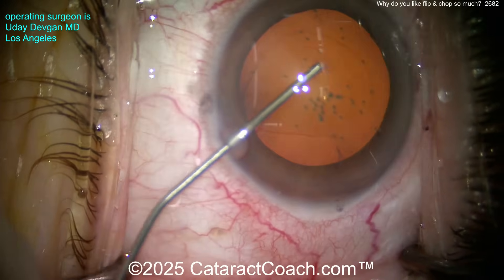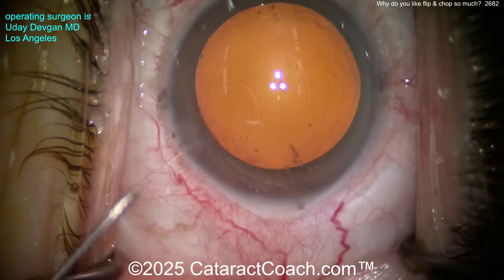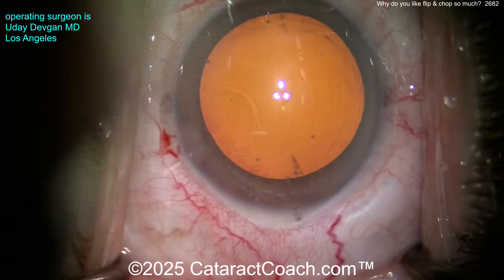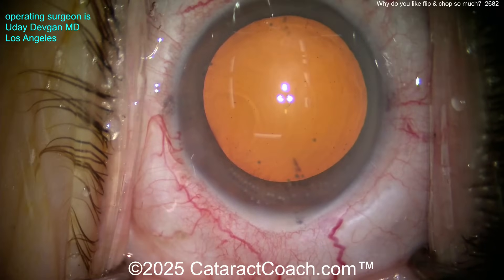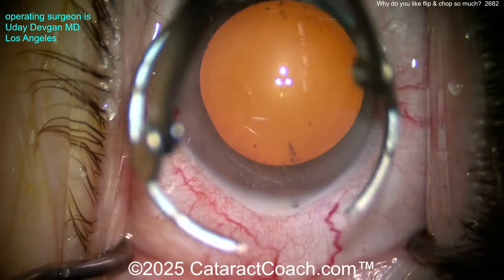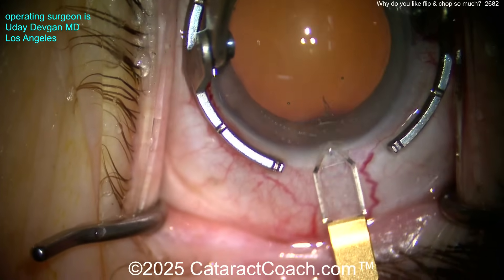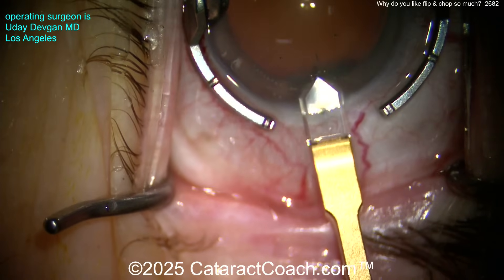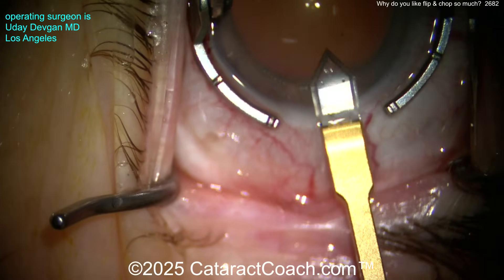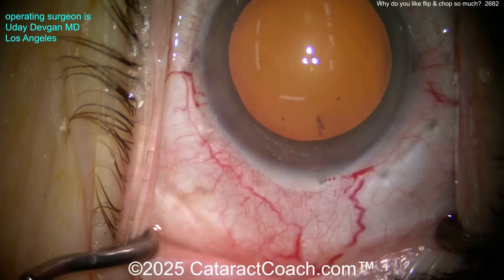Here comes our dispersive viscoelastic. Get a good fill here across the eye. Now we're going to make our main incision. I like a diamond. In flip and chop, we need to have a sufficiently large capsulorhexis — you can't do it with a four-millimeter rhexis unless it's a super soft lens, like buttery soft, zero nuclear sclerosis. This is a two-millimeter diamond, so we'll make it two and then slightly enlarge it to maybe 2.2 or 2.3 millimeters.